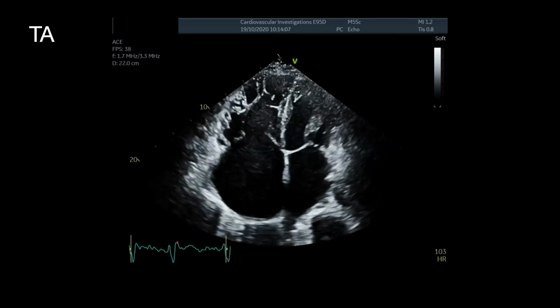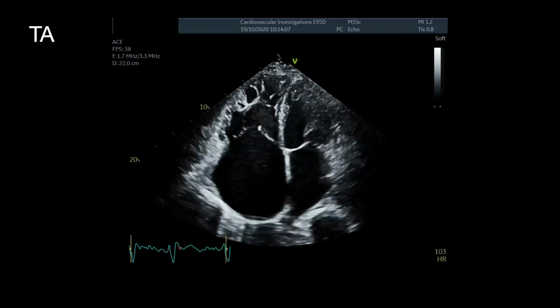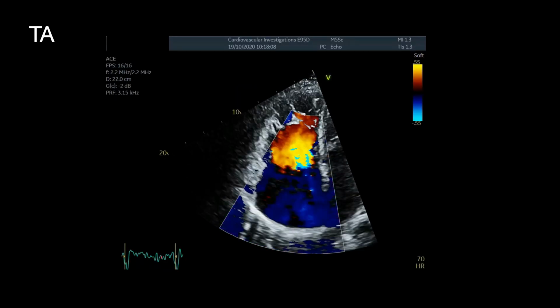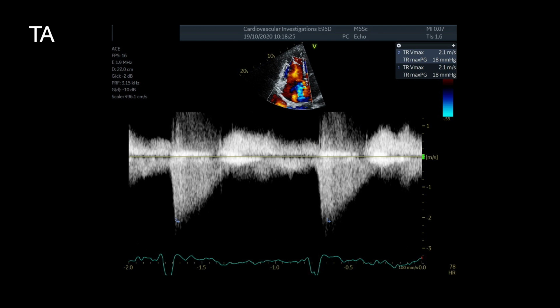And this is a nice apical 4-chamber view, heading to, probably, an RV focused view. You can see an enlarged RV, significantly enlarged RV. And I think here it's probably the clearest image we've had that the tricuspid valve leaflets are not coapting. And then with colour over that view, again, you can see that wide-necked, that's what we call wide open TR. And with that rapid equilibration of pressures, the peak velocity is low and RVSP is going to be significantly underestimated.